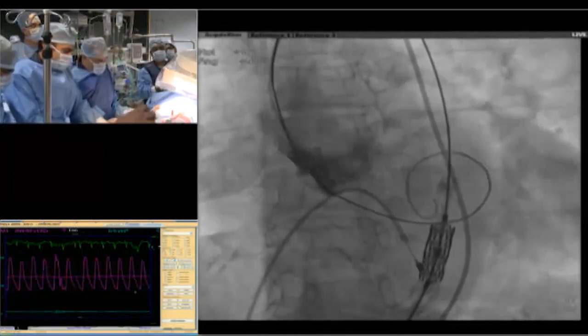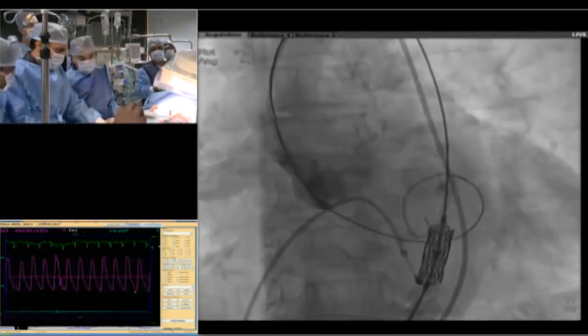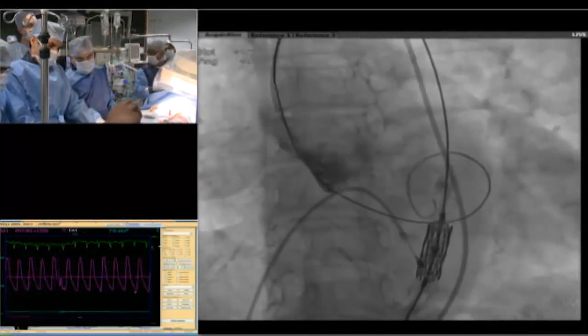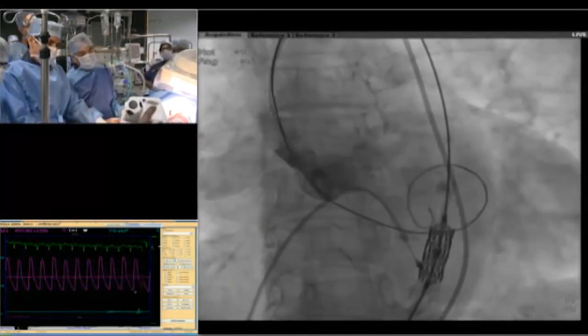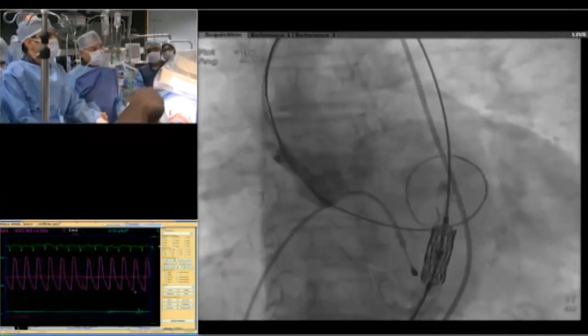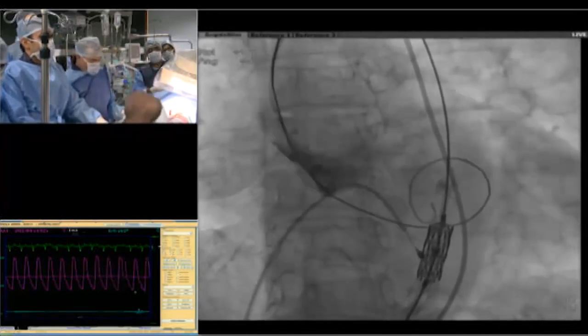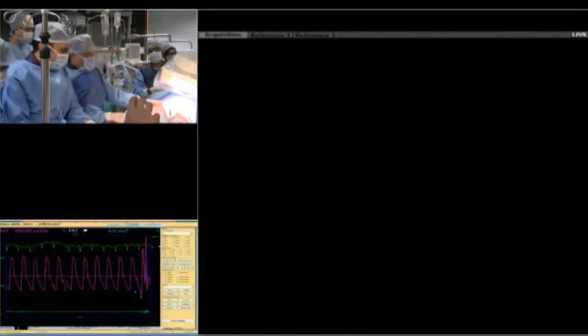What I've done is that this is a navigator catheter. Take it fully back in. Okay, now push it back. Empty the catheter of the blood. How much heparin was given? 5,000. Okay, we're okay. Our target ACT is 300 for these cases. So now you would be moving and I would be advancing. Let's go ahead.